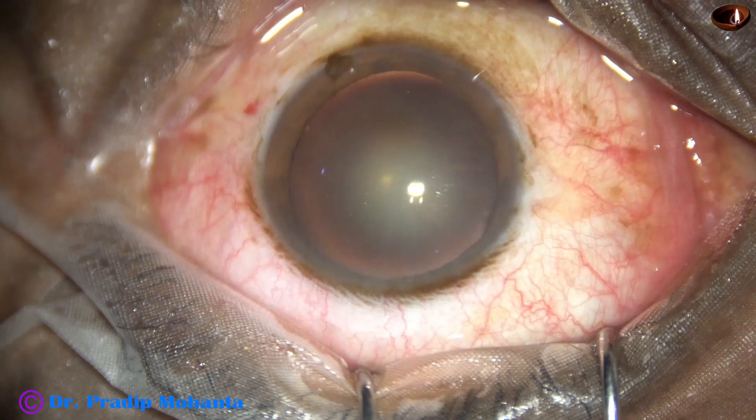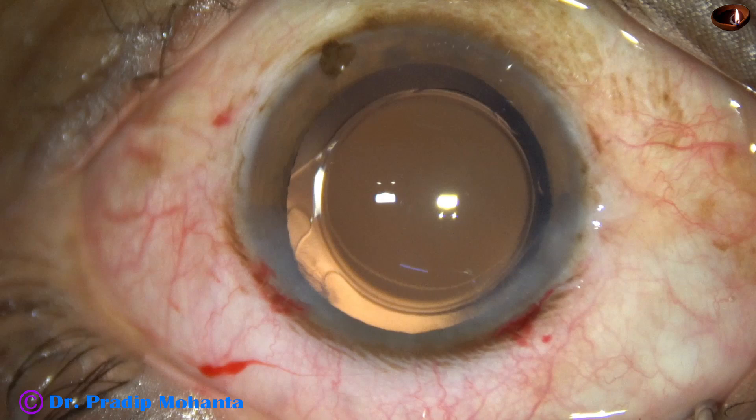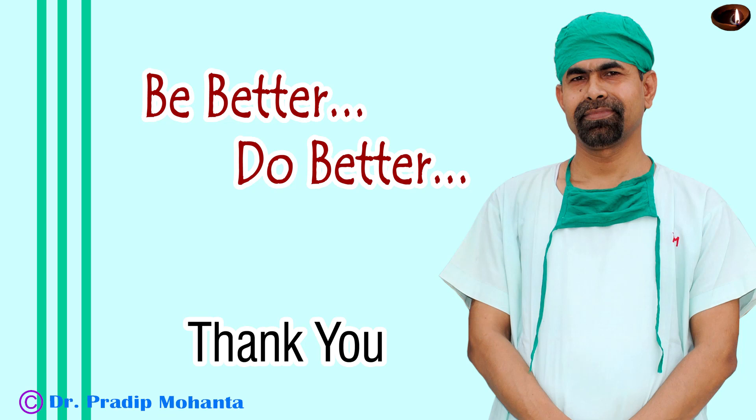We started from here and after six minutes we have reached this point. Be inspired, be a great surgeon, and serve your patients with love, respect, empathy, and great surgical competence.